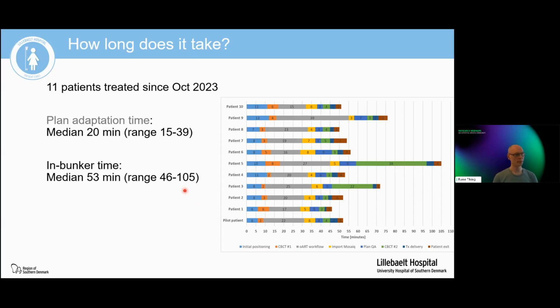The very long times are due to, well, one patient urinated on the treatment couch, and we had the linac head below the couch at that moment. So before we could treat him, we had to transfer him to another linac. And that basically added to the entire treatment time of this patient. But those things happen in real life. So we were actually quite happy to see the variations of time within this limited number of patients.